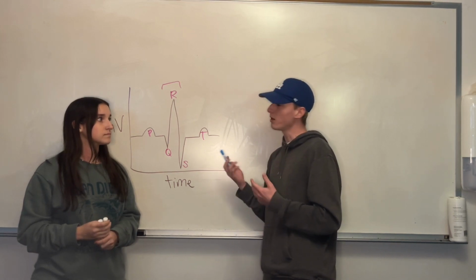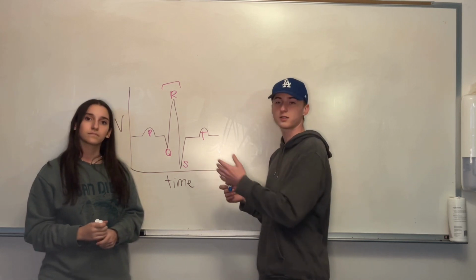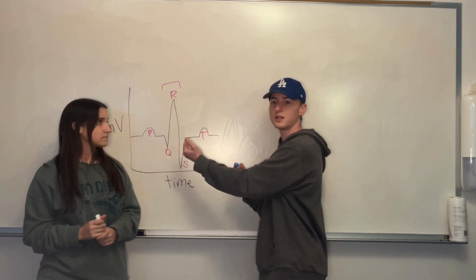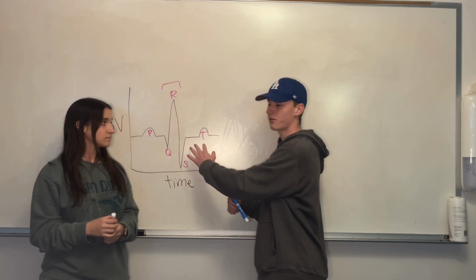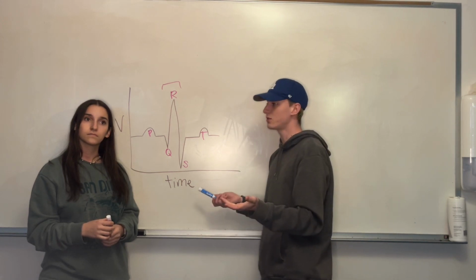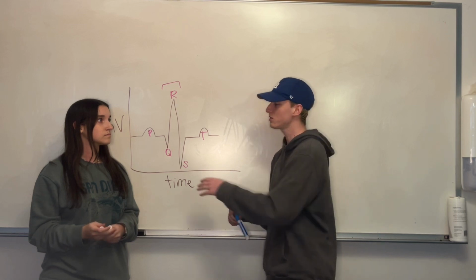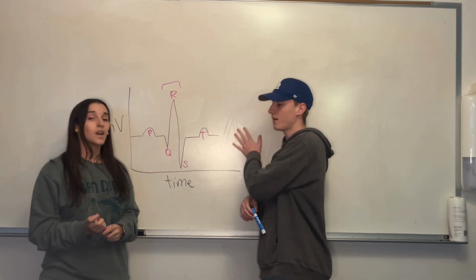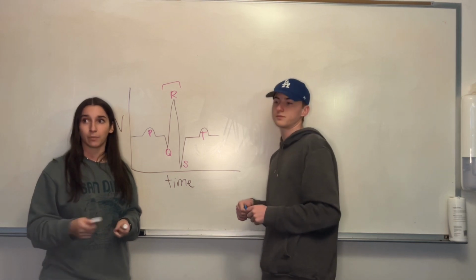So, also things to note, right? Why is this important in the first place? Well, it's important because you can actually read the amount of time each interval is going to take. Doctors are able to read if there's a different interval, if there's like myocardial infarction, atrial enlargement, and I believe that's all it mentions in the lab manual. So make sure you're just familiar with all the different waves that we have present right here. It does also mention a blockage in the conduction pathway.